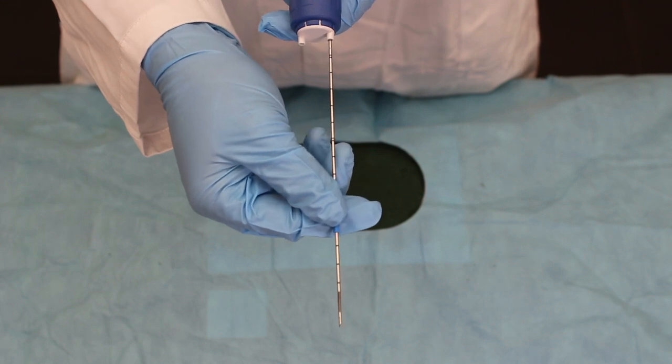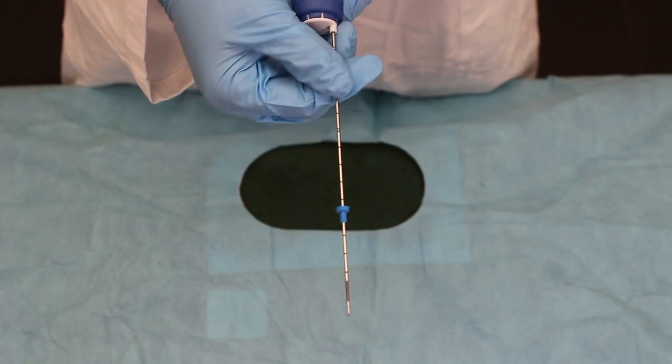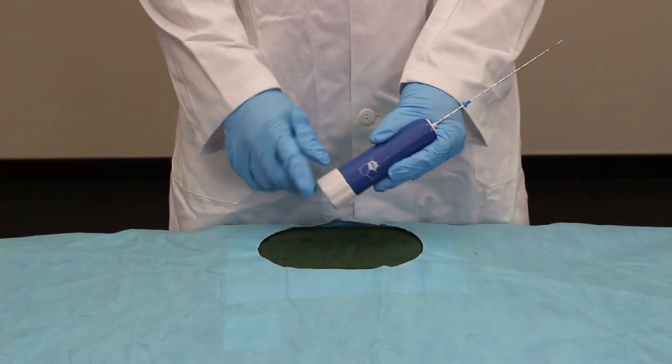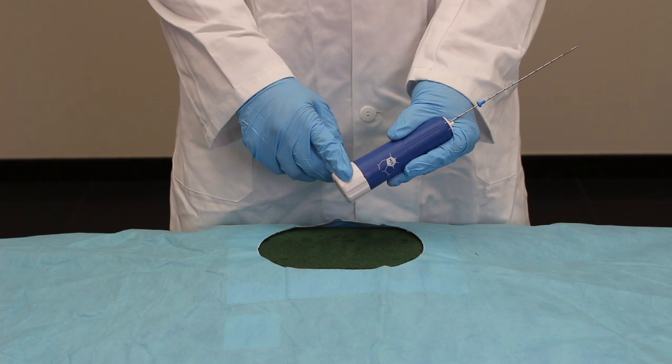Regulate the depth stopper position on the device or the coaxial needle to the desired penetration distance. Prepare the device by twisting the rotational mechanism at the end of the instrument.